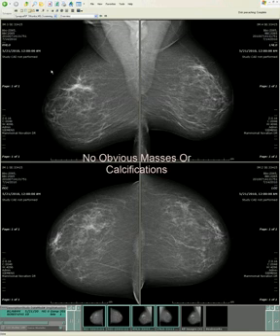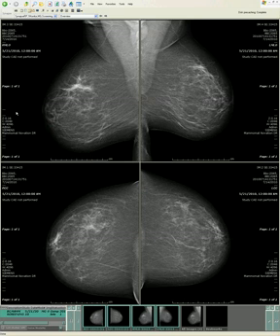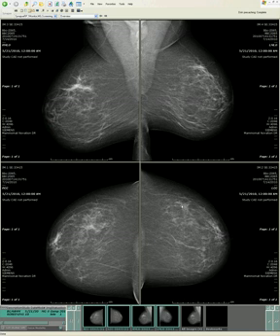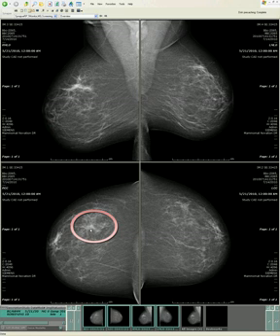We don't see an obvious mass. We don't even see any obvious calcifications. But as we do our diligent search, looking for asymmetry, we see that the fatty tissue is pretty symmetrical, especially in the medial sides on the CC view. But what about the lateral sides? There's nothing like this on the other side. So this gets our attention.